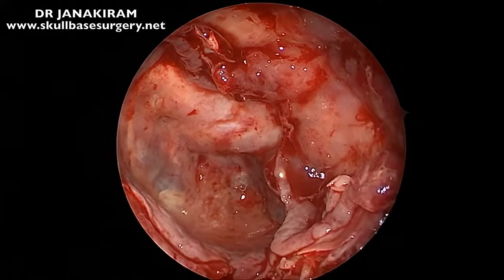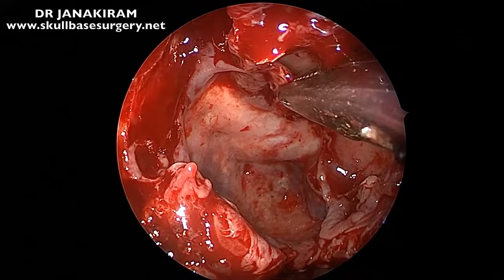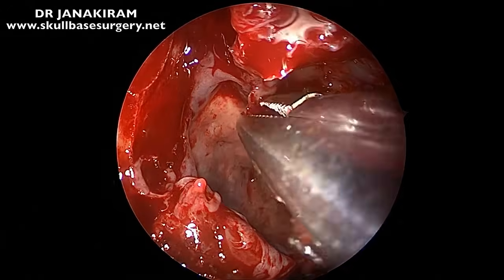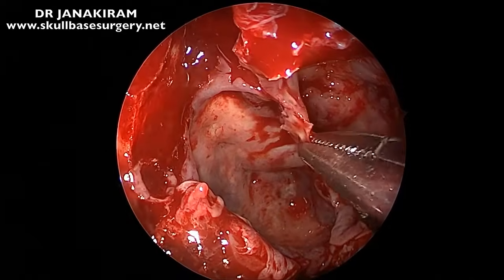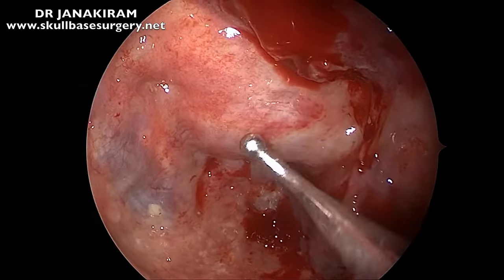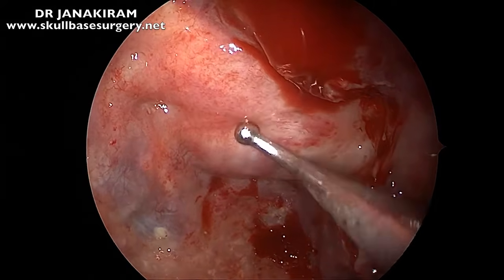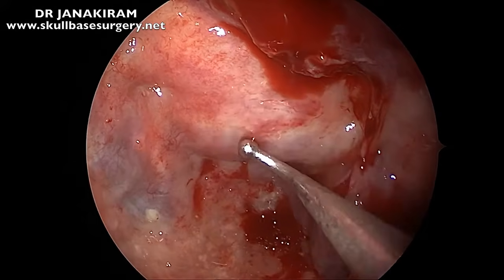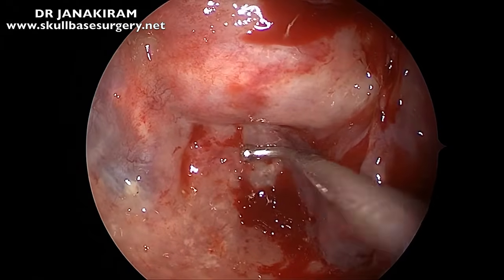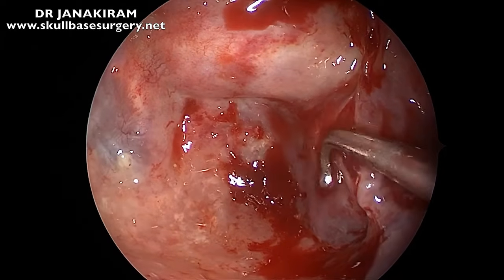Let's start from the bone above being removed from the region of the planum sphenoidale. That is the region of the planum sphenoidale which forms the roof of the sphenoid sinus. And below it will be the tuberculum sellae between the two optics. And here we are, this is the sella. You can see that there is no bone, and this is the clival recess. So the first would be in the midline, the planum, the tuberculum, the sella, and the clival recess.